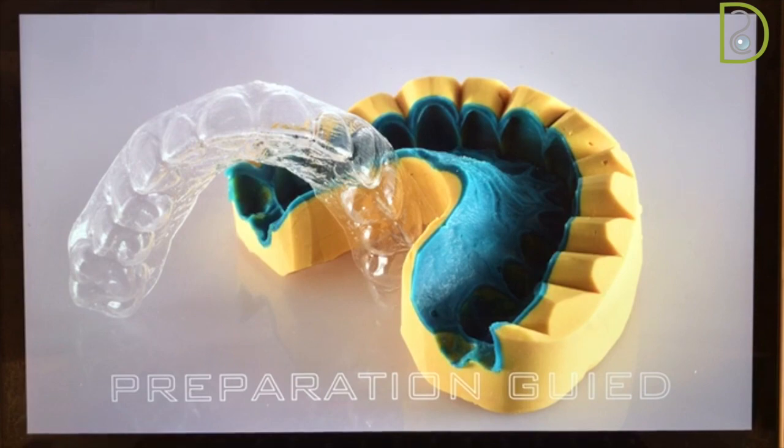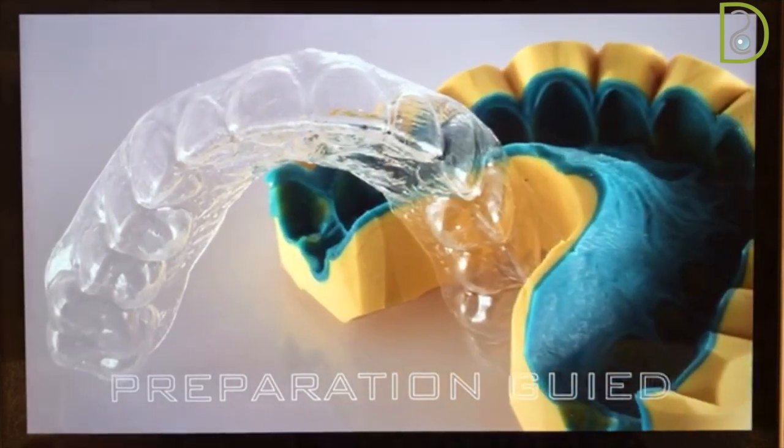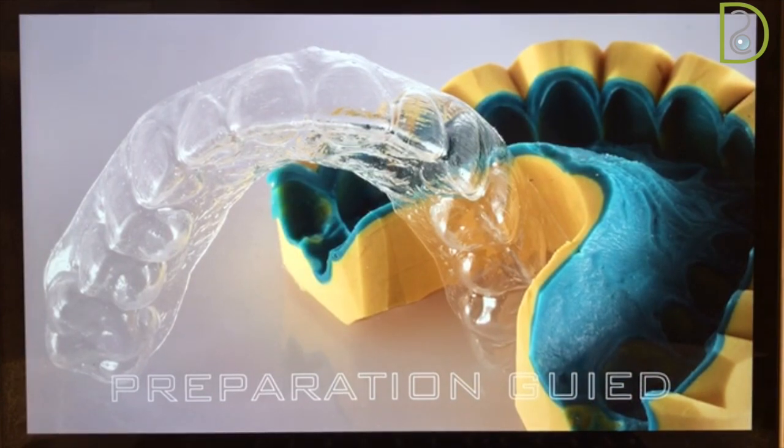Again, another use of it: after duplicating the wax up, you can perform your preparation guide. Now, what is the importance of the preparation guide? The preparation guide will allow you to control your preparation all along the treatment. So now, if you decided through the wax up that, for example, on tooth number 1 you need to remove a millimeter, half a millimeter from the tooth, how would you know that after the preparation? Again, it's by the preparation guide.